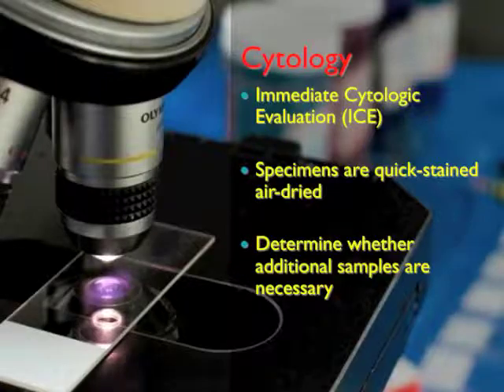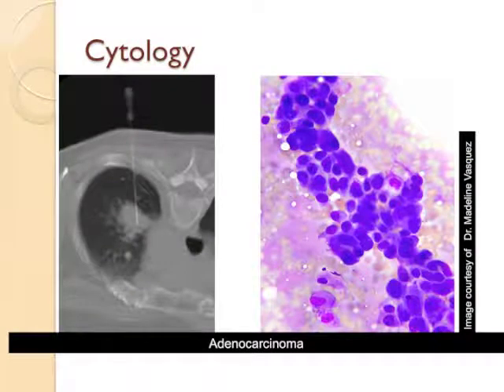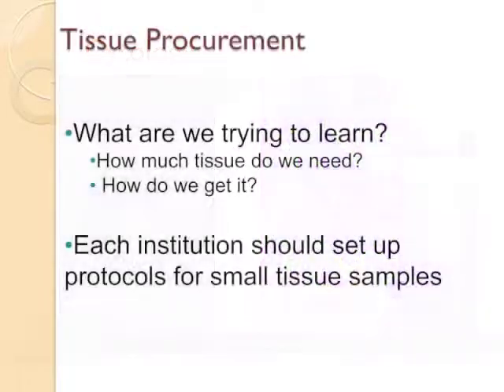Now, what do we get from these needle biopsies? We get cytology. And here you can see an example. When I do these cases, I put the needle in. It's done inside the CT scanner. I have a nurse there, I have a technician there, and I also have a cytologist present so that they can look at the specimen I obtained almost immediately, and we can tell whether or not we have an answer or not, and we can tell whether or not I need to obtain a second sample. And these are cells that are malignant that were obtained from this tumor, and we were able to tell this immediately.